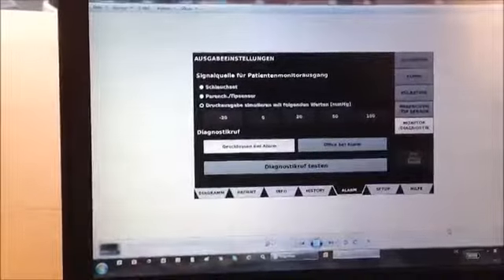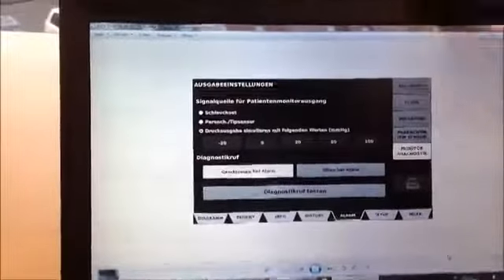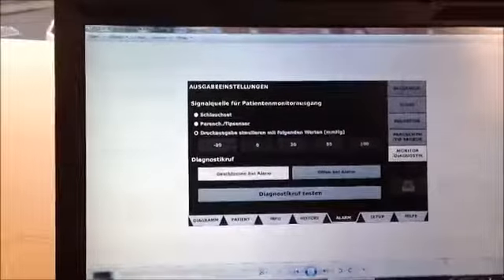and what you now see is the txt file we just created a few minutes ago, and you see the downloaded files from the LiquoGuard 7. The log files containing the patient and application information and the screenshots. When we open the user logs, we see the snapshots. Let's have an example, this one here. Here you see exactly what you saw on the LiquoGuard 7 screen as a picture.